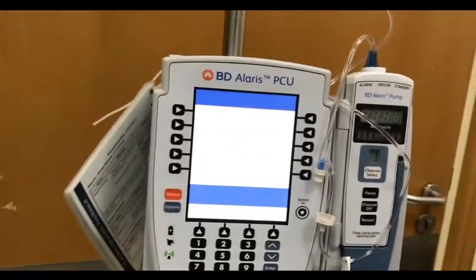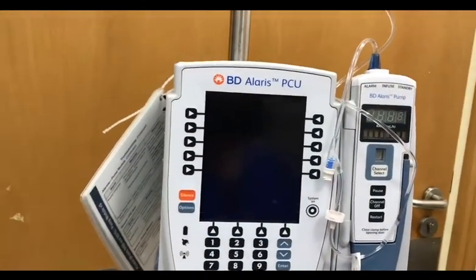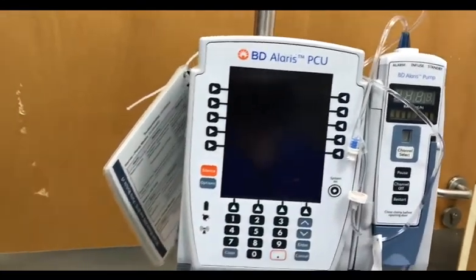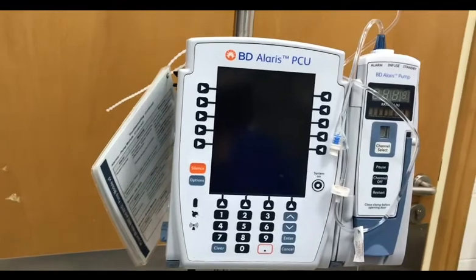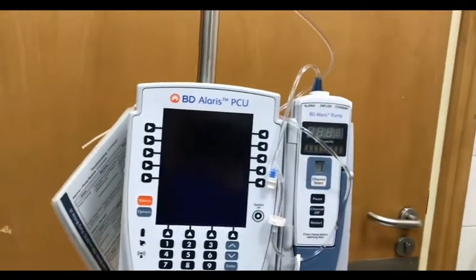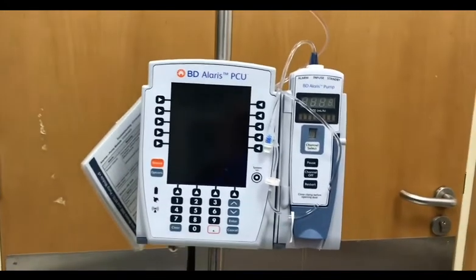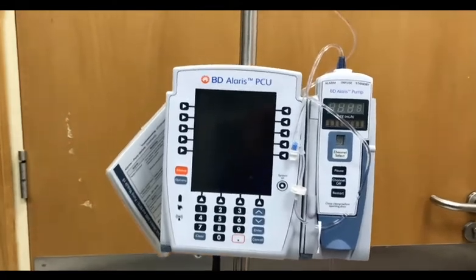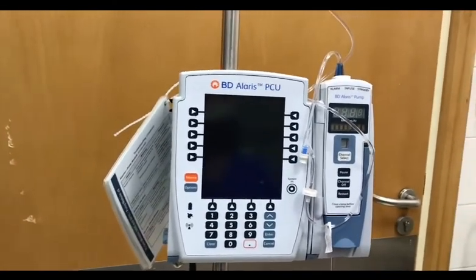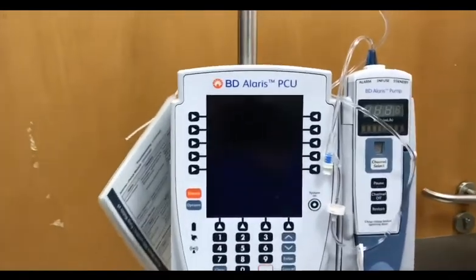And while the infusion is going, if it will take like 1 hour or half an hour to finish everything, you can still do the other task. So now here comes the multitasking. You don't have to go to the patient from time to time just to check if the infusion has been finished, but instead just wait for the machine to alarm you that it is finished. So there's another way of infusing this one.